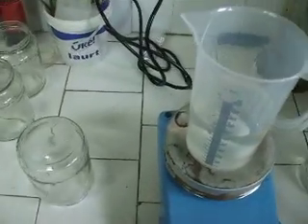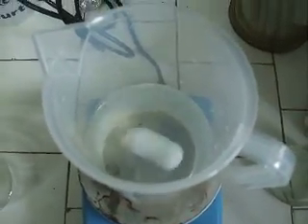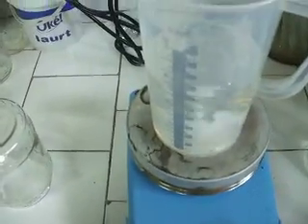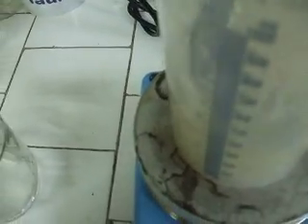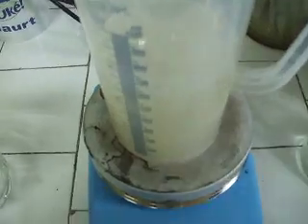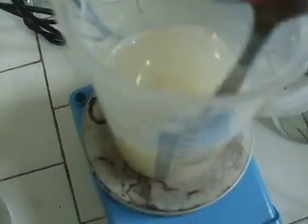This is our way of dissolving guar gum into the medium. We have to make a suspension in 3 seconds. After 3 seconds it starts thickening. And at this time I was fast enough. I hope so.